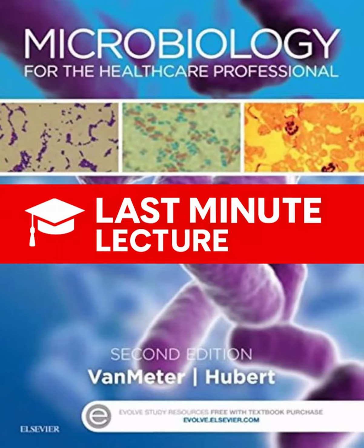But even faster and more precise is looking at the genetics, right? Molecular analysis. Absolutely. That's really the cutting edge and often the most definitive, molecular or genetic analysis. Especially given how incredibly diverse microbes are, this is super important for bugs that are slow growing or maybe can't even be grown in culture easily, or ones that look identical biochemically but are actually different species. How does it work, basically, cutting up DNA?